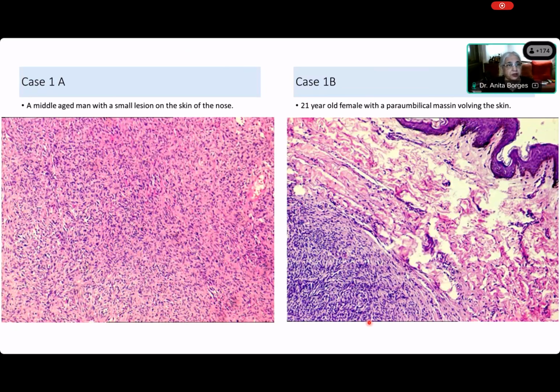So read the history and tell me what you see. Middle-aged man with a small lesion on the skin of the nose. And that's case 1A. And what is 1B? 1B is a 21-year-old female with a paraumbilical mass involving the skin. Exactly. So both of them are cutaneous lesions, right? Yes, ma'am. Excellent, Saida. Now come on, describe what you're seeing. This is fairly low power.